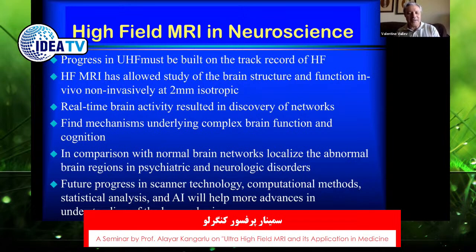Very nice talk. One of the questions that I have is when you step away from the protons. And yes, the gyromagnetic ratios are important, but when you go to carbon 13, nitrogen 15, oxygen 17, unlike phosphorus 31 and the proton, those elements have 1% or less of natural abundance. So do you add contrast agents, and how do you deal with that? I mean, don't these elements have to get metabolized before you do any imaging and analysis?